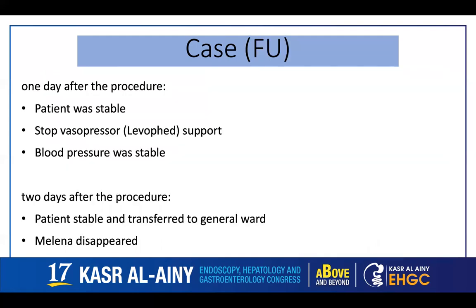And 1 day after the procedure, the patient was stable and stopped the vasopressor. Blood pressure returned to normal. 2 days after the procedure, patient was transferred from ICU to general ward, and melena stopped.